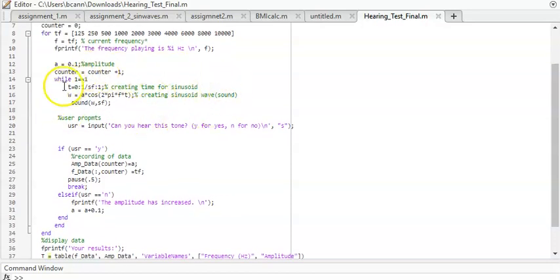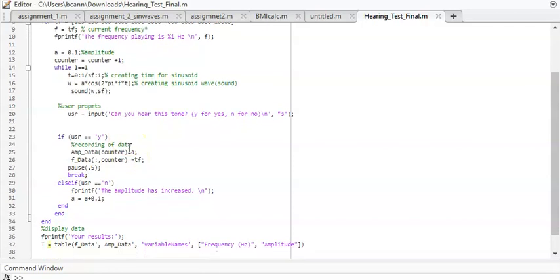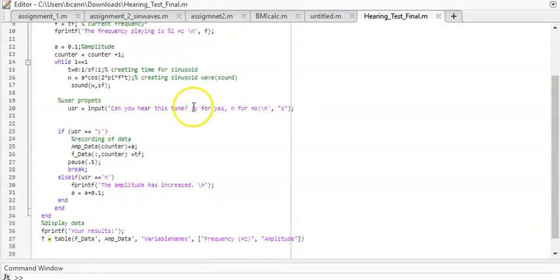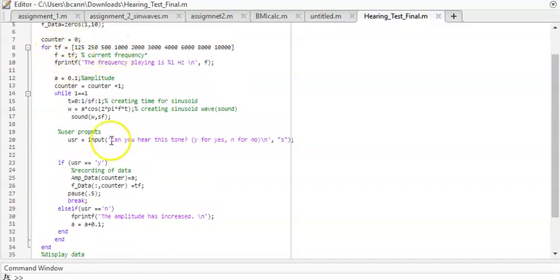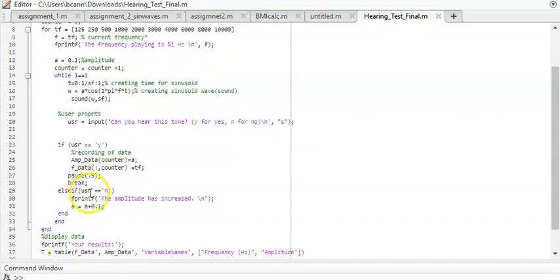Just this part is to create the sinusoid wave so we can create the noise so the user can see if they can hear it. If the user can hear the tone, they will either put a yes or no entry in. If they put in yes, then we will record the data of the amplitude and the frequency and put a pause, break the loop, which is this while loop here, which will then again go back into the for loop to the next frequency. If the user enters a N for no, it will increase the amplitude and redo the while loop until they can hear it.